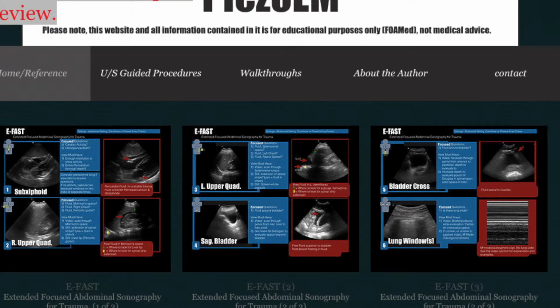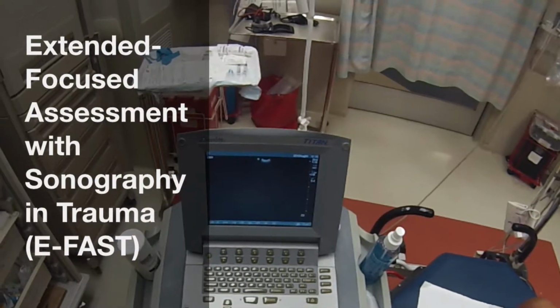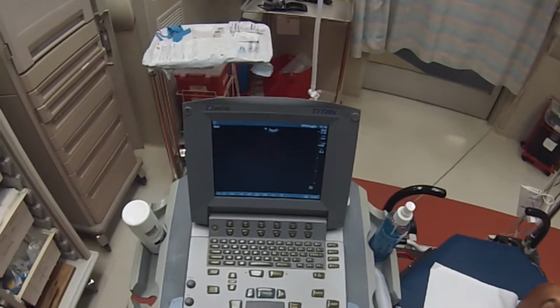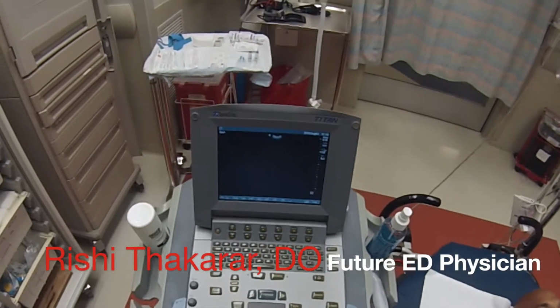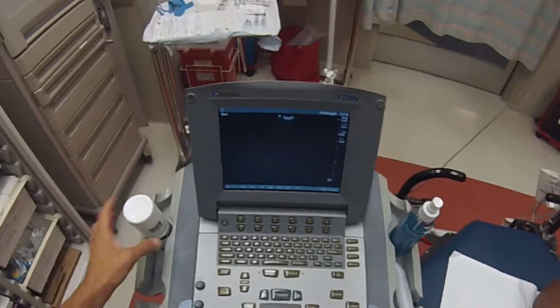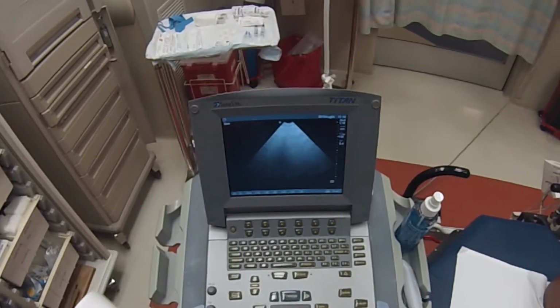So there you go. Hey guys, Justin Stowens here again in our trauma bay with two of my med students who are volunteering here to be my guinea pigs to show you guys how to do the FAST scan. We're again here with our Titan SonoSite machine and I'm going to run through it quick and show you how this works. So we're again using the curvilinear probe.